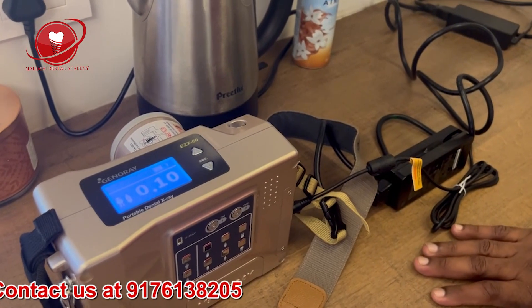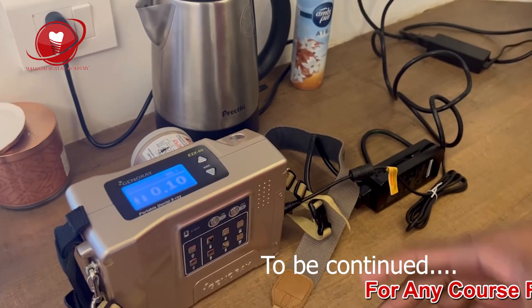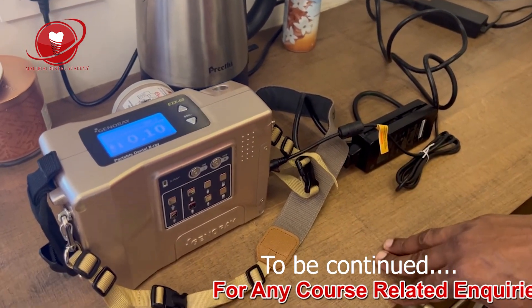After using the machine, I'll put up a Part 2 video with my feedback. This was the unboxing video. In Part 2, I'll show you the battery life, image quality, handling — everything.